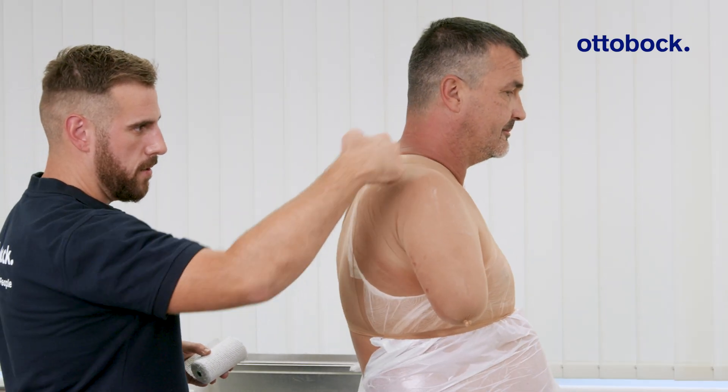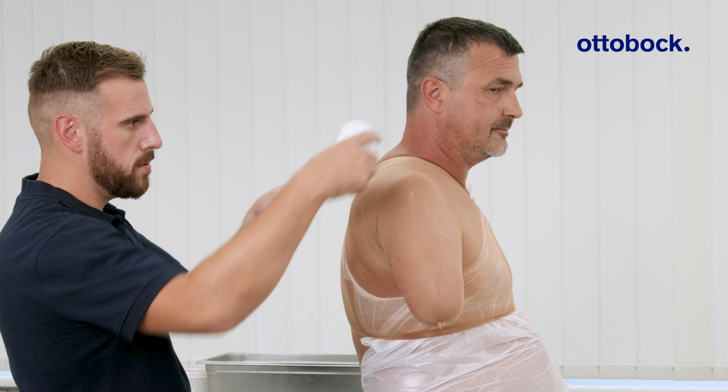Then prepare a six-layer connecting strip and place it over the shoulder to link the two splints.